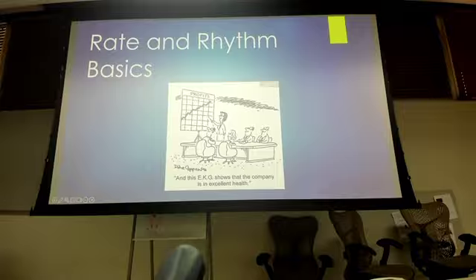But what changes those reflections on the EKG is where the positive and the negative are located inside the electrode. And we are not going to focus on how the EKG machine does that if I have a positive and a negative over here and a positive and a negative in this one leg. We don't care. What we care about is the end result. Or at least we don't care today and in this course, right? Because I don't know how the EKG machine does it. It is set up by someone way smarter than me to be able to read that and identify this is lead 1, this is lead 2, this is lead 3. And so that was the first thing we talked about.